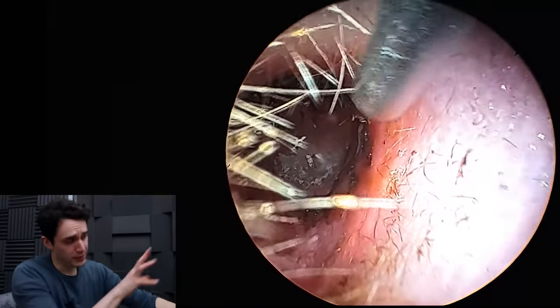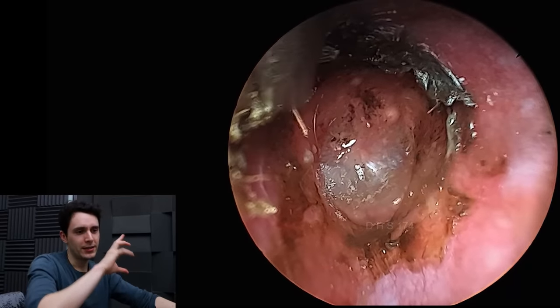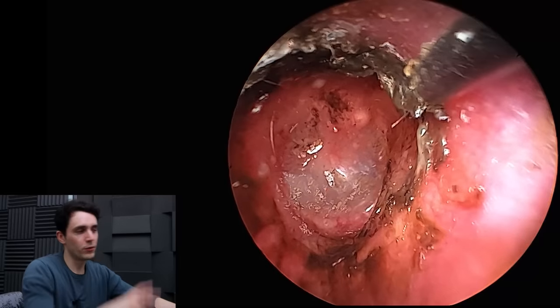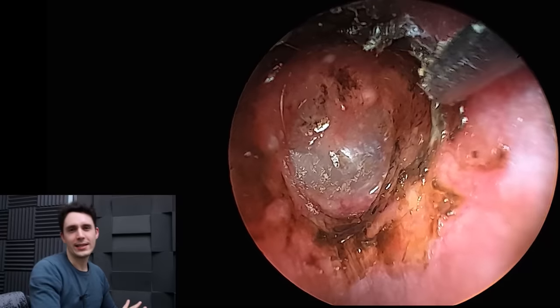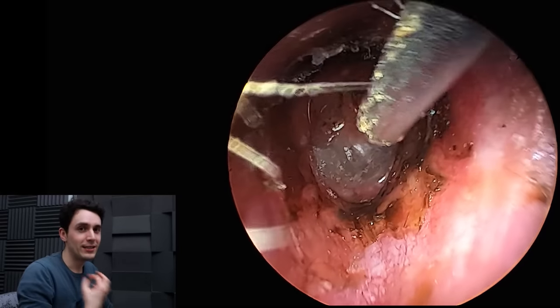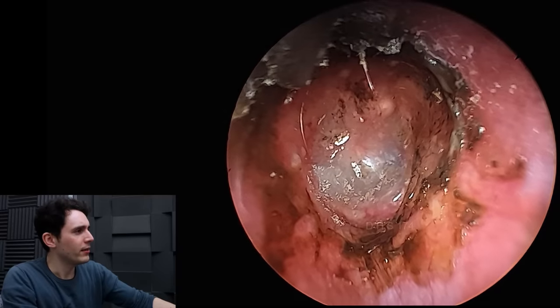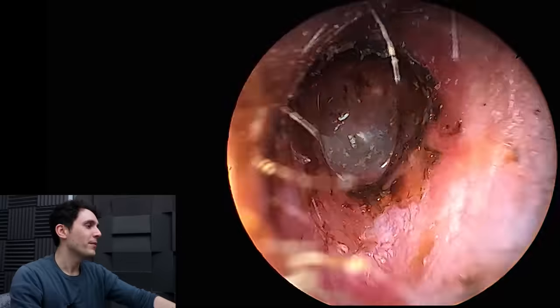Having a skilled approach with manual tools is actually extremely important, particularly when you come across a foreign body or fungal growth — not cases where the ear is just full of fungal growth and mycelium — but when you come across a weird or really difficult case, that's when manual tools are so important. So I'm going to make an effort to use them more. We're just tidying up the roof of the canal here, but the patient has been through a lot so we'll let him off.